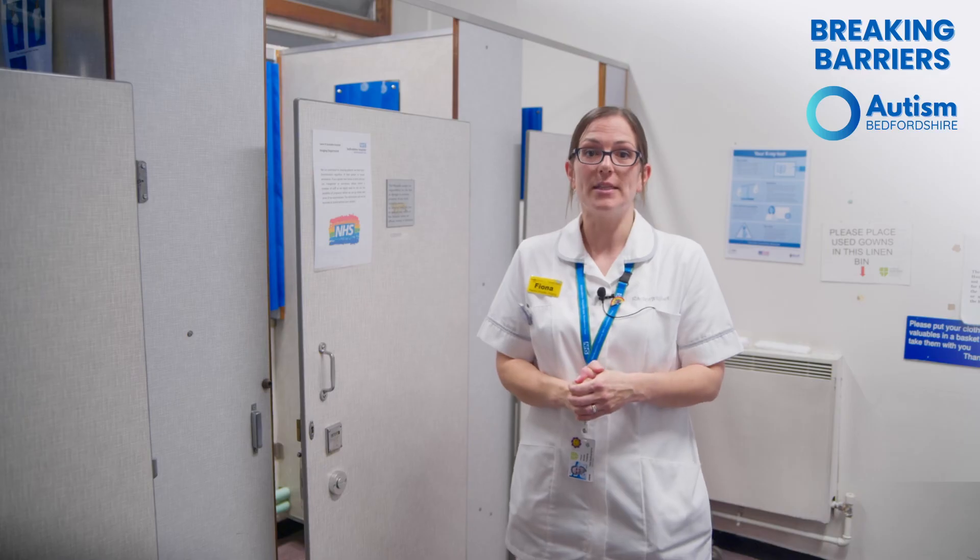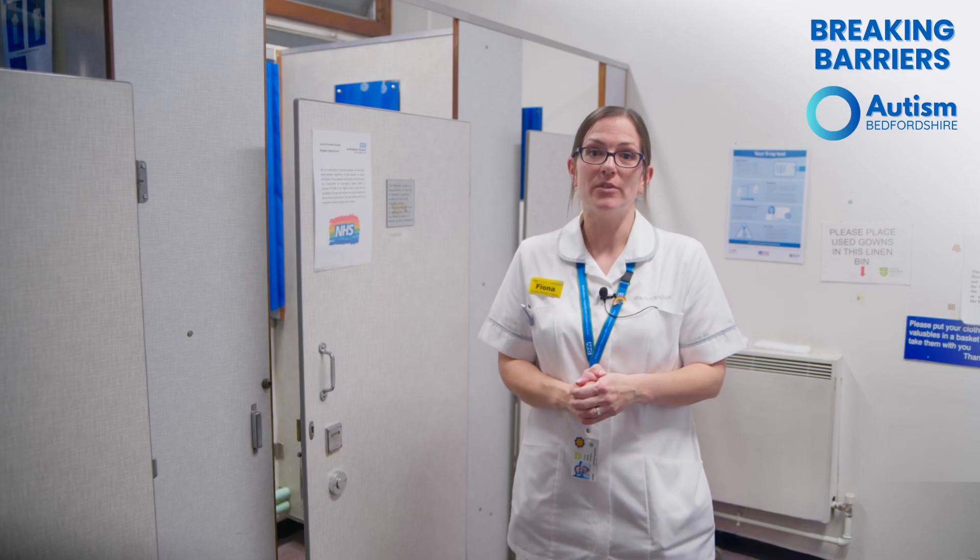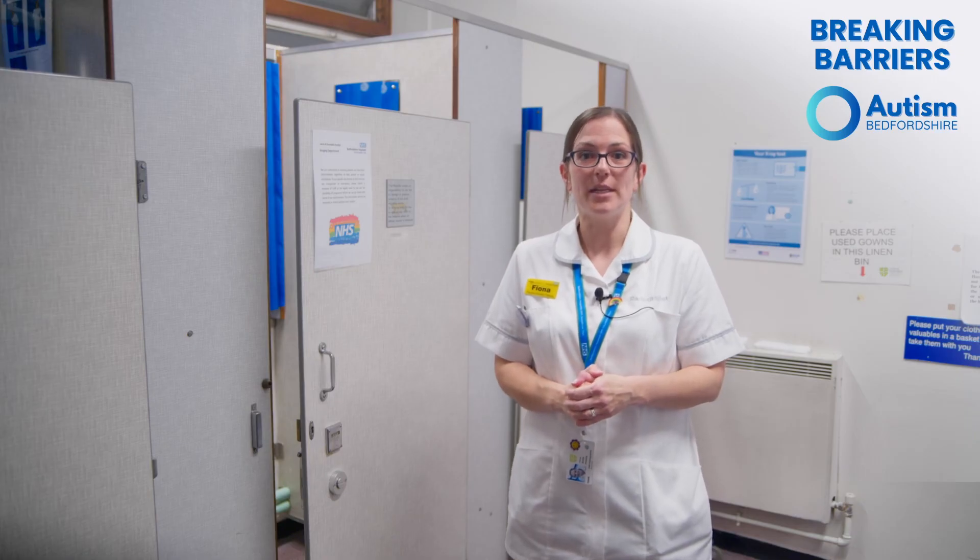You may be asked to remove some jewellery for x-rays, such as taking off a necklace for a chest x-ray, removing a ring for a finger x-ray, or a bracelet or watch for a wrist x-ray. You can keep the jewellery in the room with you and will have time to put it back on before you leave.